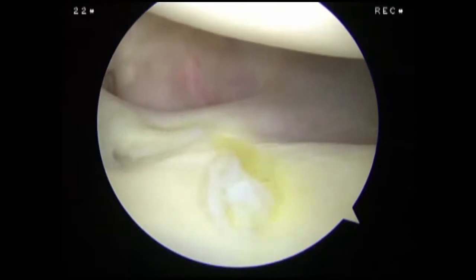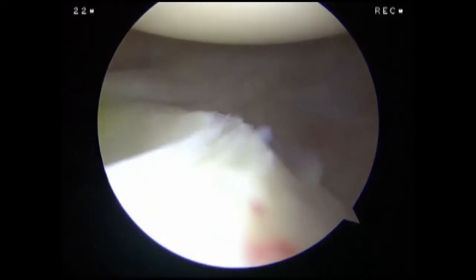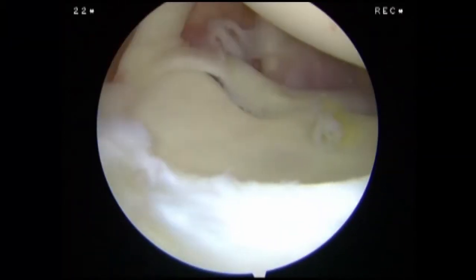We examine the anterior band of the inferior glenohumeral ligament, followed by the entire inferior glenohumeral ligament. We assess the anterior inferior labrum and glenoid cartilage, followed by the posterior labrum.